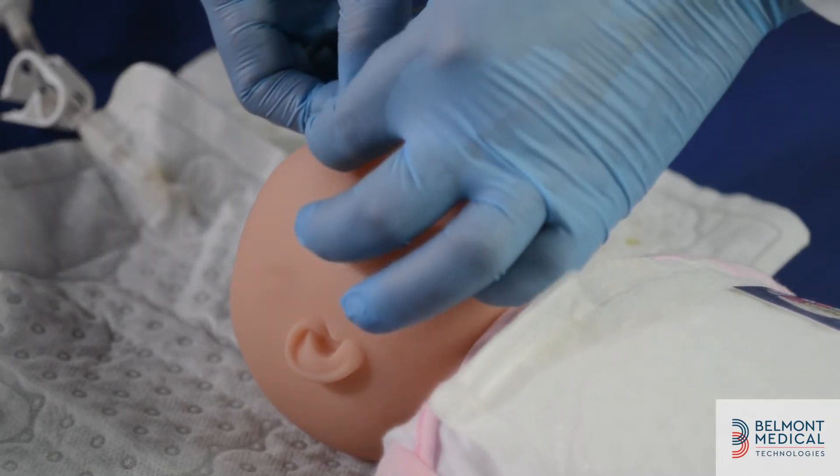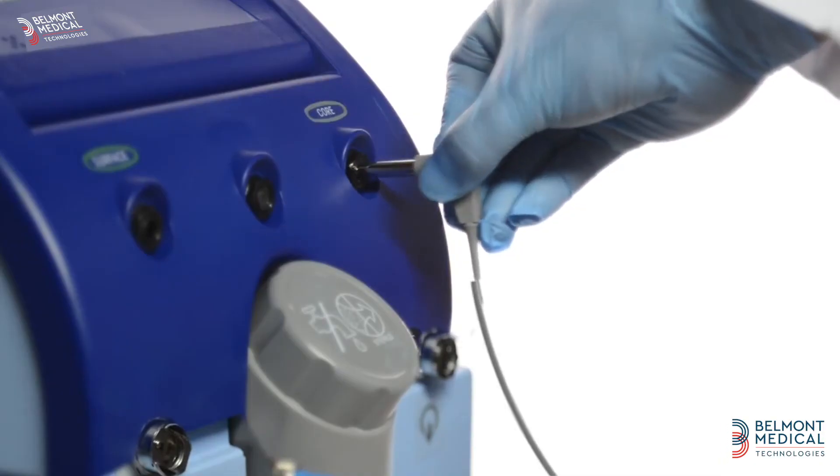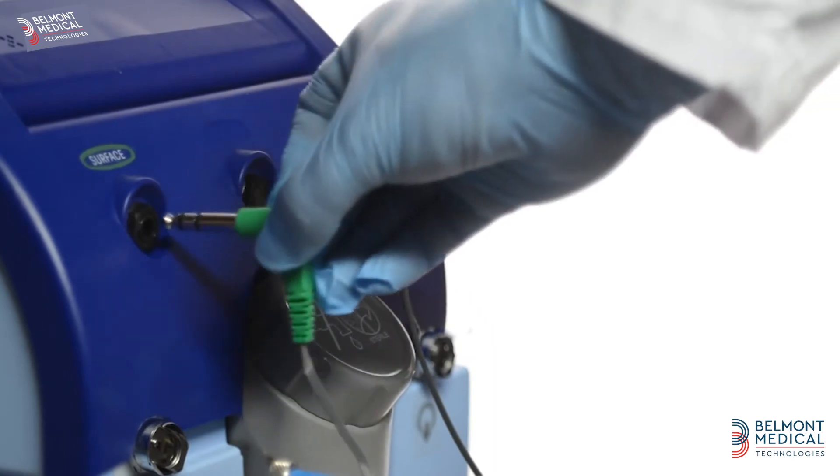Position the core and surface temperature probes. The patient's core temperature can be measured via esophageal or rectal temperature. Connect the temperature probes: gray for core, green for surface.